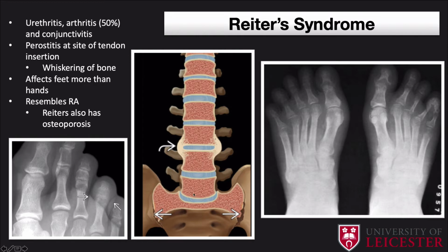So the other things to really remember would be the bony bridging, and you get this paravertebral ossification across the vertebral bodies. Things to also note, you get enthesiopathic changes similar to that in psoriasis. Sometimes you can get ossification at the junctions, for example, the Achilles tendon on the calcaneum or the patella. And really you're looking for these very subtle changes.